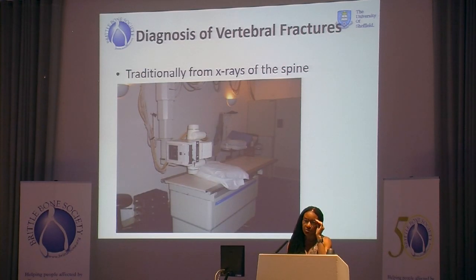Ordinarily, we diagnose vertebral fractures by looking at the spine radiographs. It's very rare that a child will come in with a mild vertebral fracture as a symptomatic presentation with back pain. It's important to pick them up because otherwise they progress and it can lead to finally relatively significant deformity if not treated. And the traditional way we do an X-ray of the spine, we call that a radiograph.